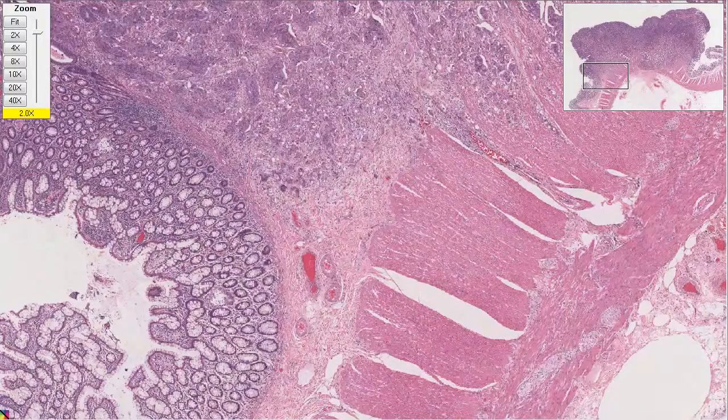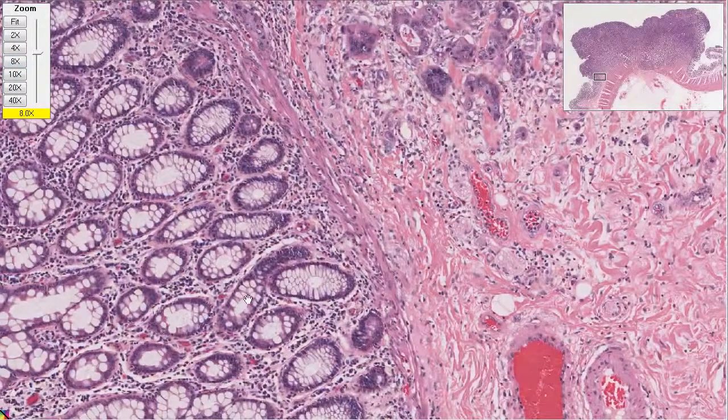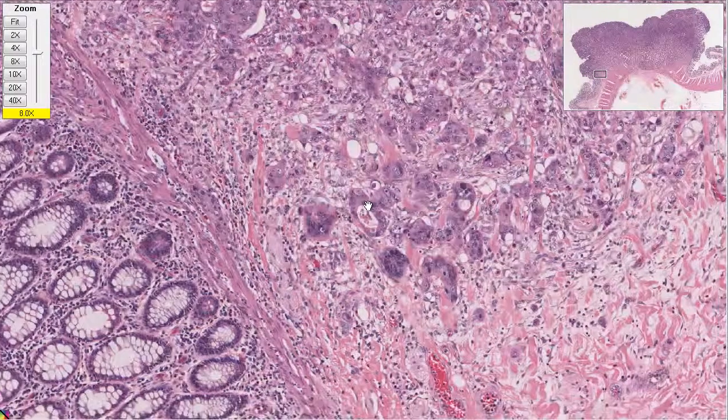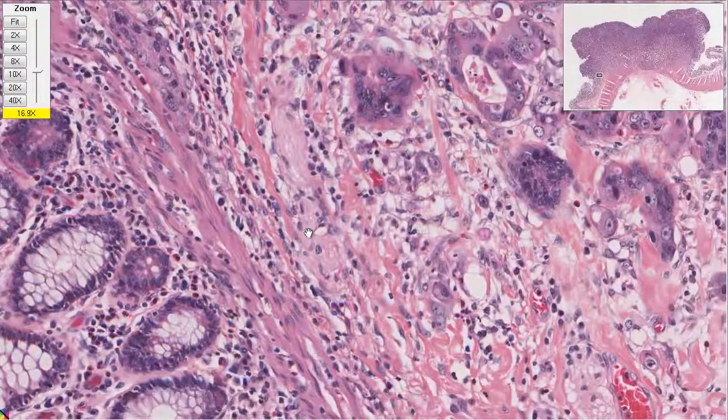All right. So then as you go in deeper, these are the areas which are normal, but this is all kind of coming out, growing out in all directions. This is now where you can see the cancer next to the normal. We had talked before about dysplasia. This is really bad. Dysplasia with a capital D. Small children off the street could tell you that this is bad. After they watch this video, definitely.